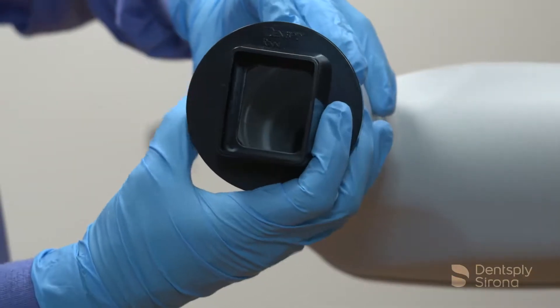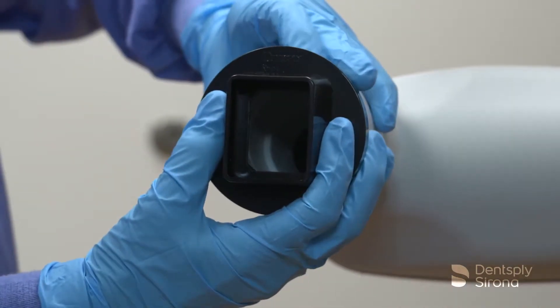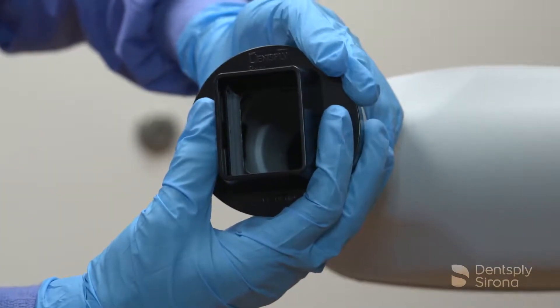To insert the RIN universal collimator into the PID, squeeze the legs toward the center of the unit and push into the PID.